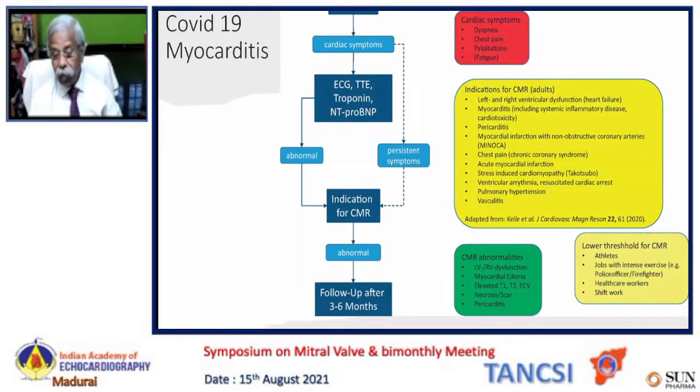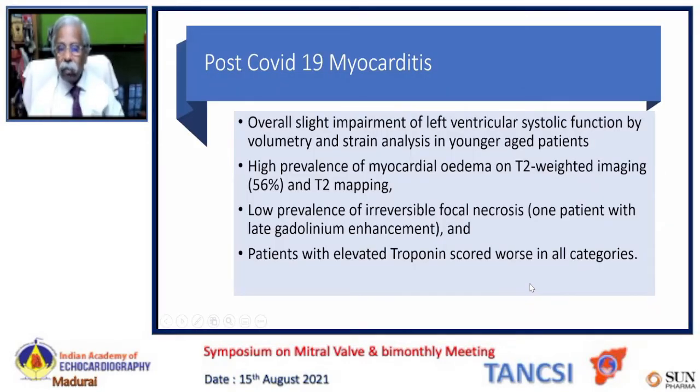But the late gadolinium enhancement occurs only in around 7%. So among the CMR abnormalities, the LV and RV dysfunction and myocardial edema are a more characteristic form rather than LGE. In young patients, you see only slight impairment of the left ventricular systolic function, and there is a high prevalence of myocardial edema and low prevalence of irreversible focal necrosis, that is the LGE.